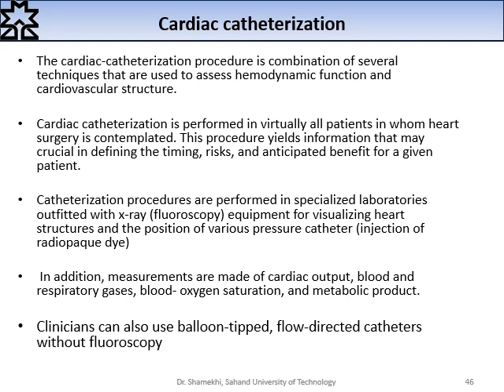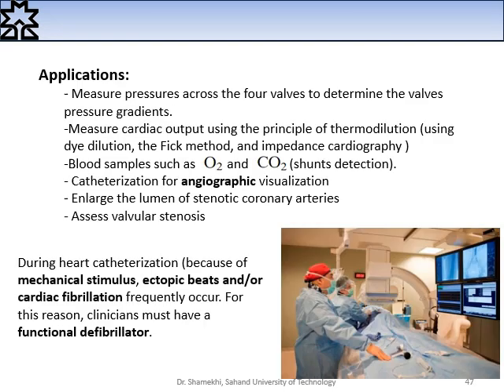In addition, measurements are made of cardiac output, blood and respiratory gases, blood oxygen saturation, and metabolic products. The clinician can also use a balloon-tipped flow-directed catheter without fluoroscopy. The applications of cardiac catheterization can be categorized as follows.